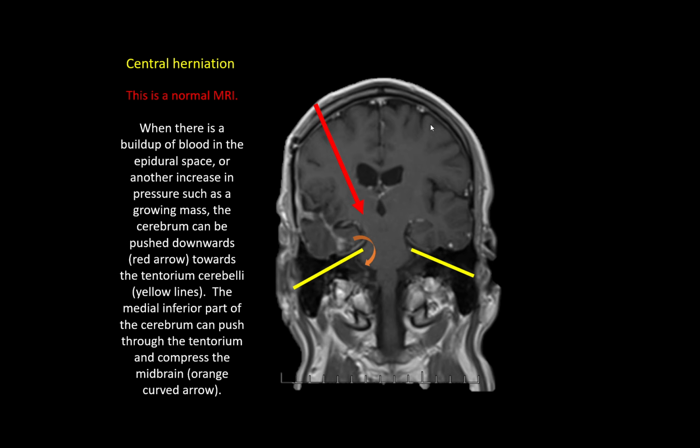So here you can see the cerebrum is kind of shut into this bony capsule. And anything that causes an increase of pressure, whether it's a tumor, whether it's bleeding, whether it's edema, it will push the cerebrum downwards towards the very tough tissue called the tentorium cerebelli that exists. And you'll be seeing that as we cut out the brain, that it's a very, very tough tissue and it's not very forgiving.